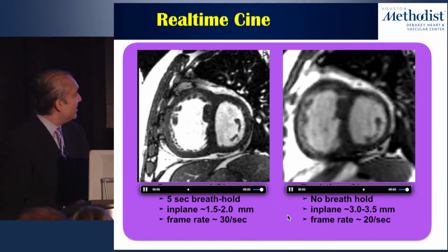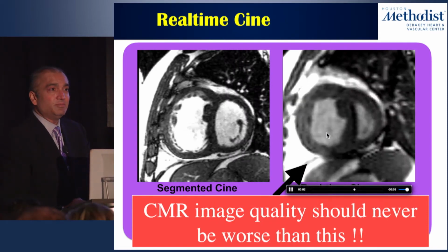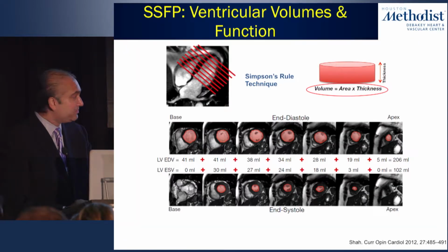But what I always tell my techs and my fellows is we should never have an image that looks worse than this. So this is the worst quality image you'll ever get on a CMR scan. And I think it's still not that bad of a quality image.